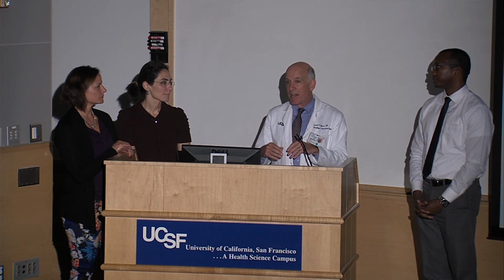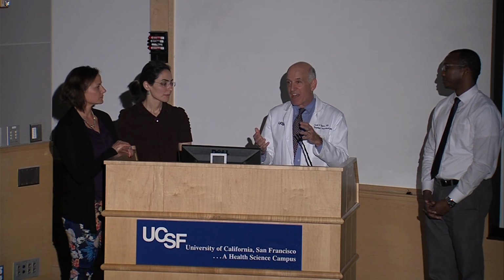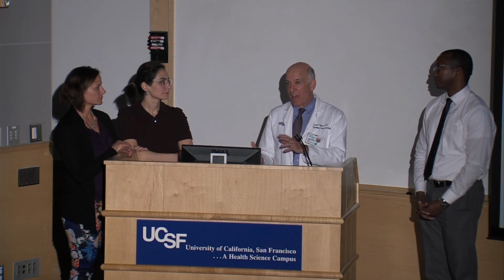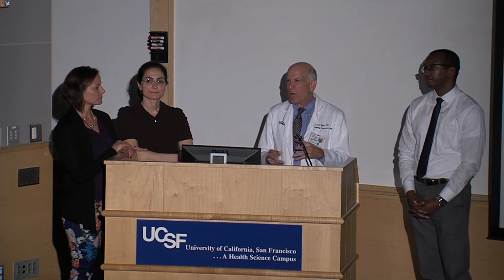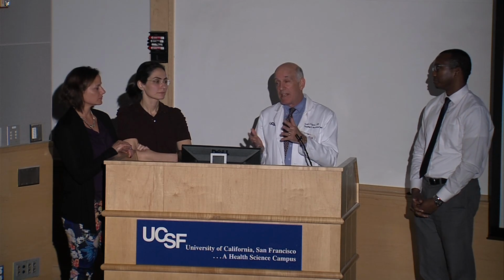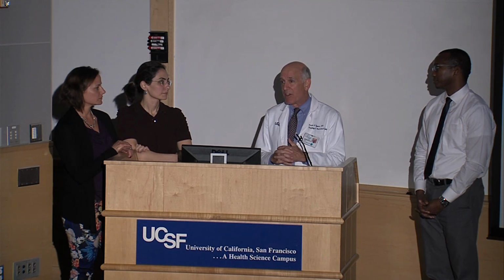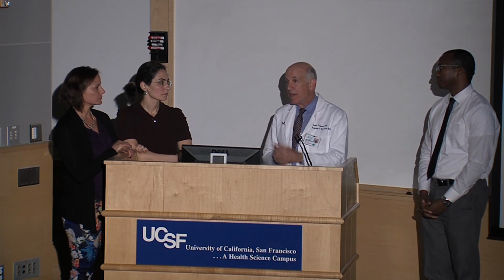But the time on it, it works real quickly with CT. We've got a lot of scanners. You can run patients through them diagnostically quickly. So if I tie it up for an hour, that's okay. Whereas MR, the time and expense is much greater. And there really is no benefit to using MR for what I do. What they do when they're working completely outside the body and where these tumors are not like hanging off the organ necessarily like mine are, I think it's easier probably to visualize them with MR. And they have the temperature thing.